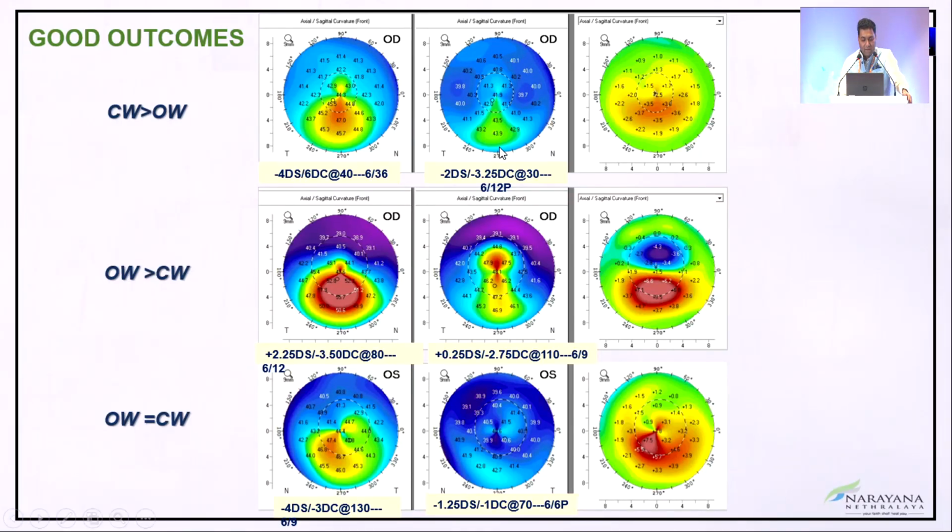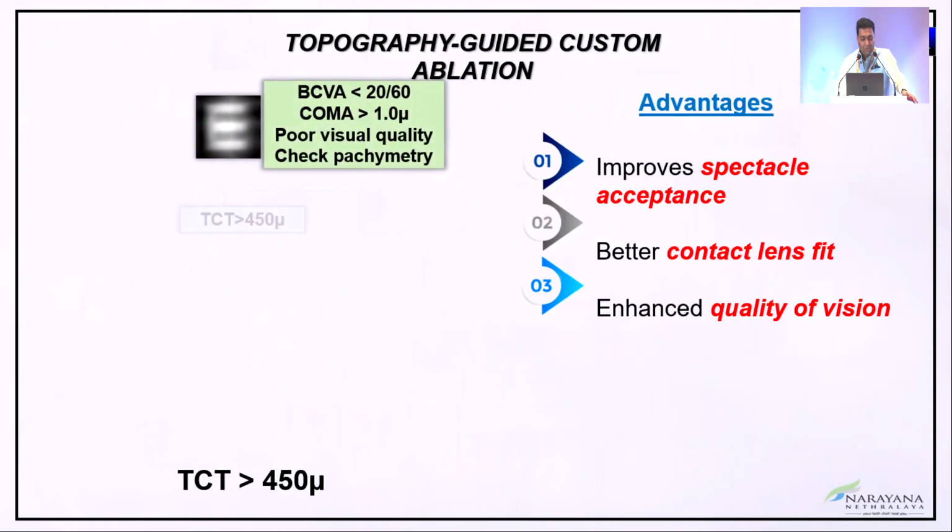We have been doing it for the last 8.5 years now, and we have just published long-term results of this, with very stable refraction and a very, very small number of patients who needed a repeat cross-linking.